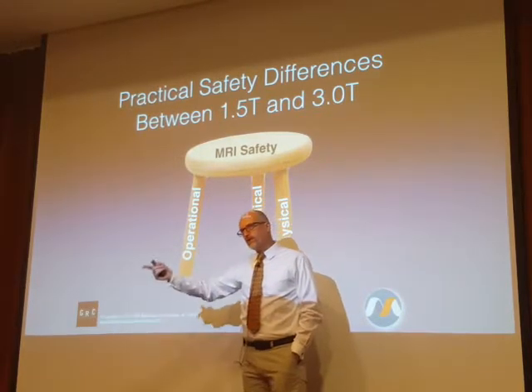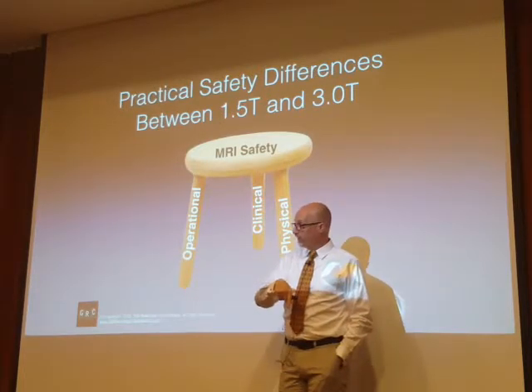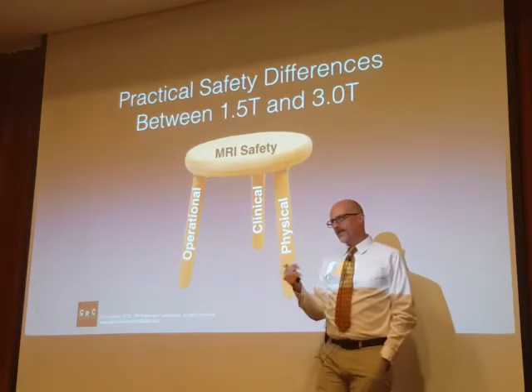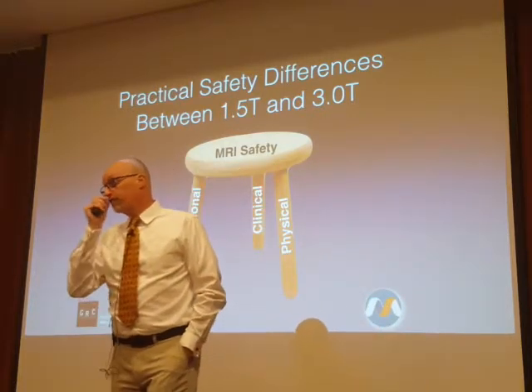Anything that you want to do at 3T are things that you ought to be doing at 1.5. The only element that really is going to change, potentially, is clinical, and that's really related to implant and device safety.